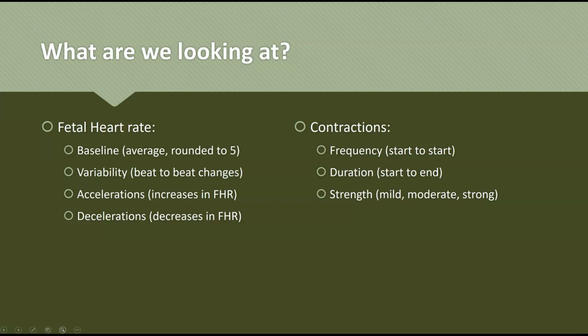So we talk about changes in fetal heart rate being periodic or episodic. And that has to do with whether the changes, those accelerations and decelerations, are in line with contractions or they happen irregardless of contractions. Another important piece to monitoring contractions is that our external methods a lot of times don't pick up contractions as accurately as they are happening. So we go very strongly off mom's report of pain and contractions because she is our best source of data for that.